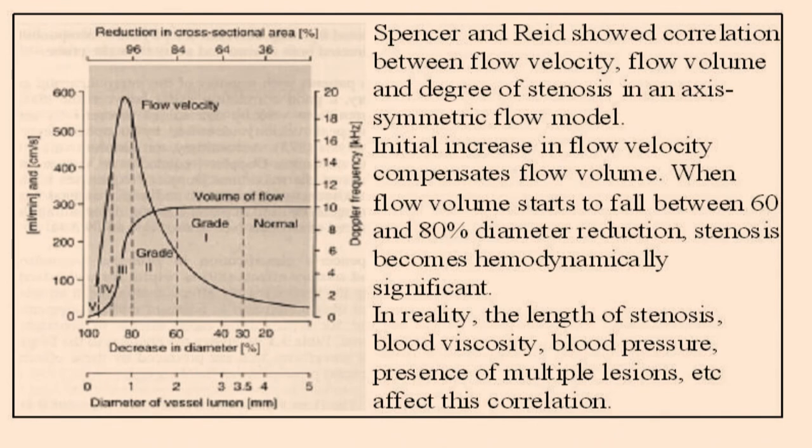And when these two curves are crossing, I hope you can see my mouse on the display. I'm seeing it on mine. It looks like you can see it on yours. But there's a curve crossing at about 70% diameter reduction. It means that during that narrowed vessel, through the cross section you cannot deliver the same amount of flow volume through.